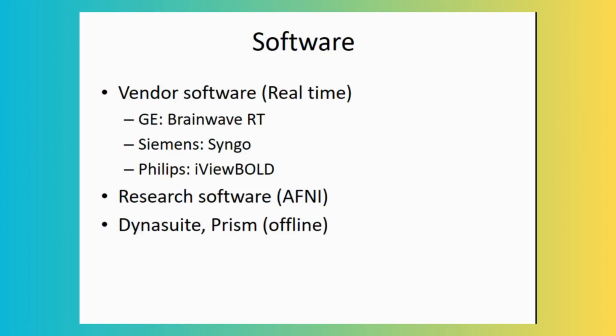Then we have software to post-process this data, like Siemens. We have Siemens and we have Syngo. We are downstairs. They are used for DTI imaging, and different vendors have different software, and then there are some offline ones also, available online, that we can use. I've used Dynasuite.